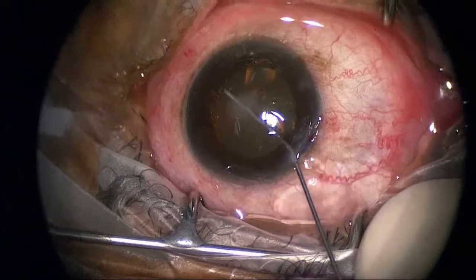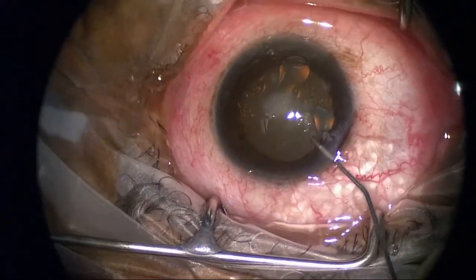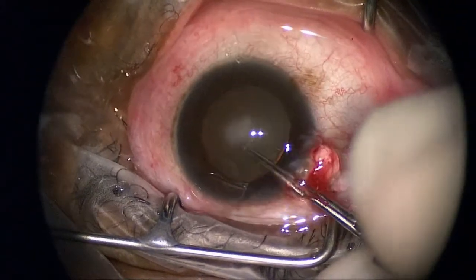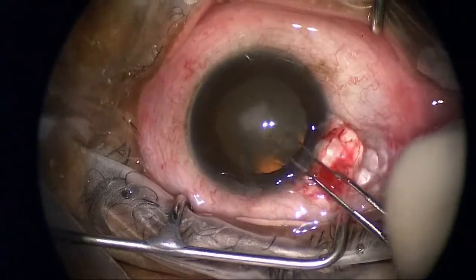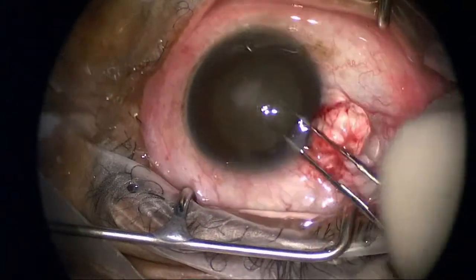What I'm injecting here is viscoelastic in preparation for performing the capsulorhexis. That little opacification on the anterior surface is a bullous lesion — essentially a blister on the surface of the cornea.